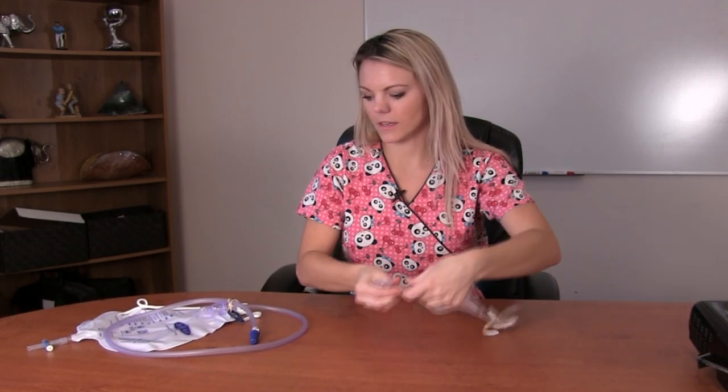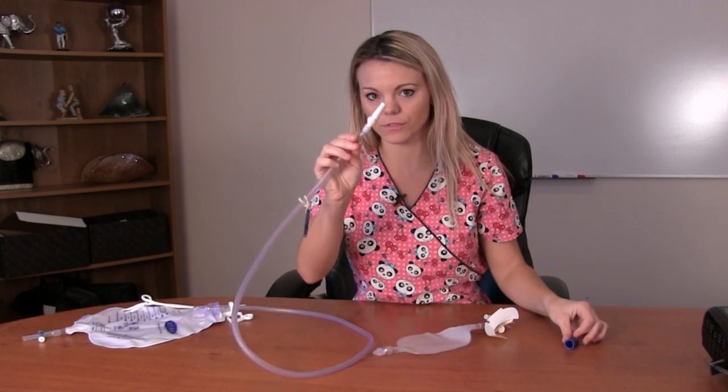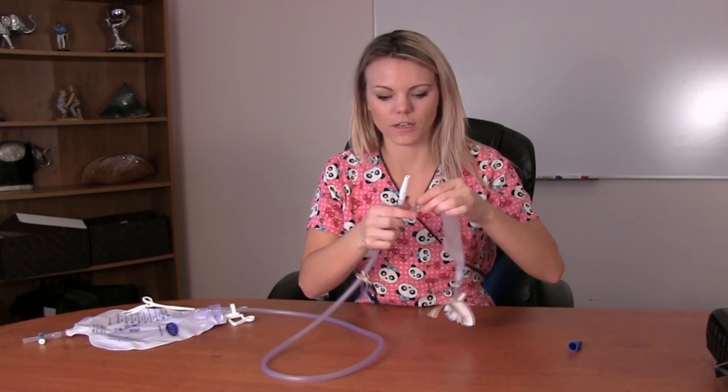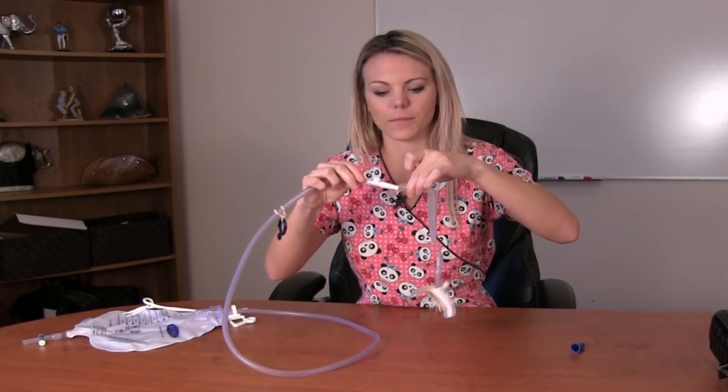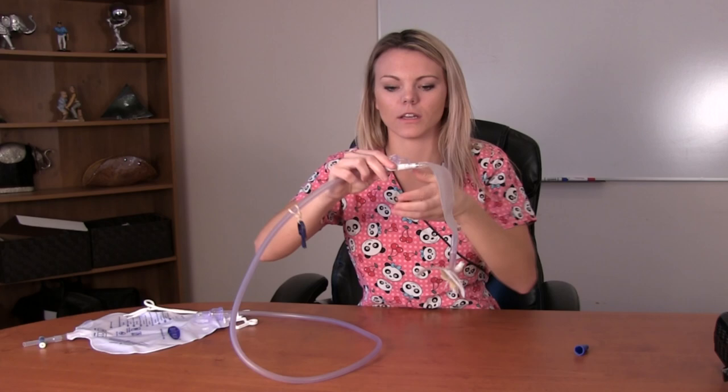What you will do is take the bottom drain where the urine is drained out and simply unplug it. Then take your night bag — there's a long tube, and at the end of the tube you have a blue cap that you simply remove. I always say it looks like a Christmas tree, and you just plug it together to make that connection. As you can see, about half of the Christmas tree is inside of the plug.